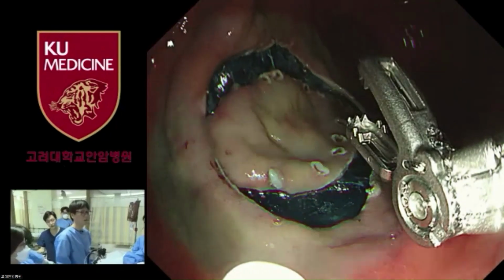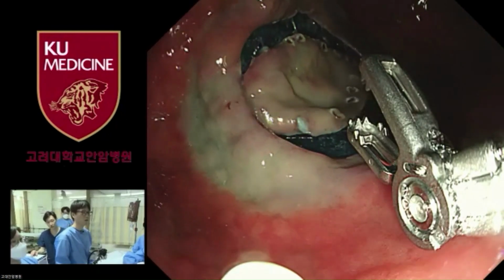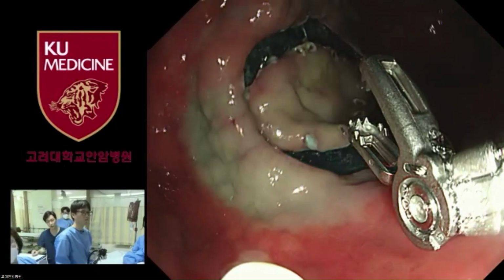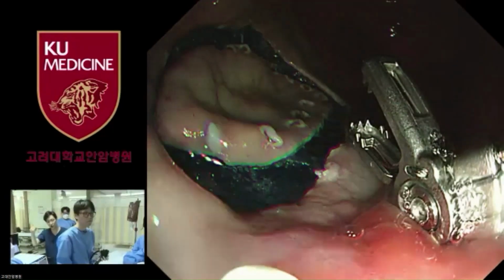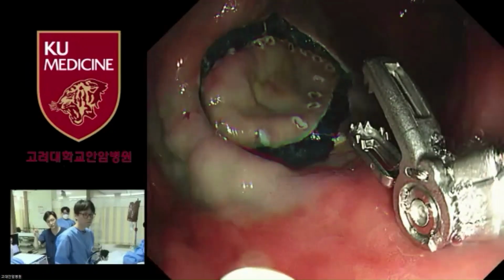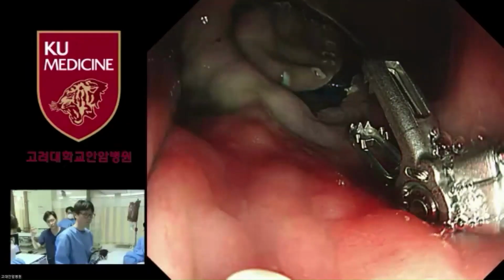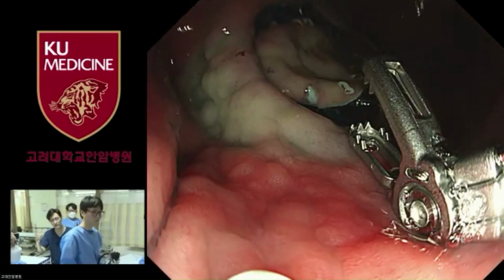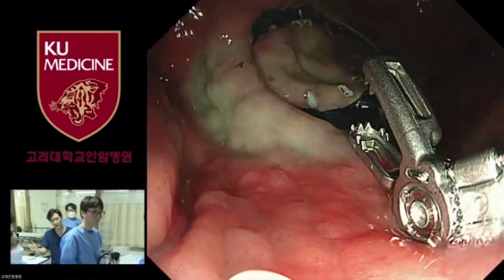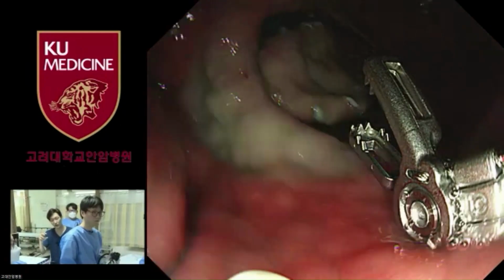Anyway, we're going to show you the robotic device for lower. We can use this device for lower also, but as you can see, there is the protruding controlling arm, so we can use this device maybe only for the rectum. If you want to go further up to the sigmoid colon, descending, transverse, or ascending colon, it's not easy to advance with this device on. So that's why this device can usually be used for the upper GI side.